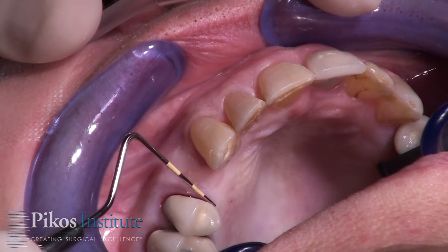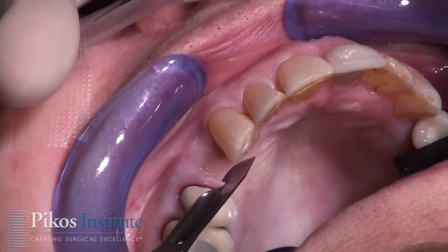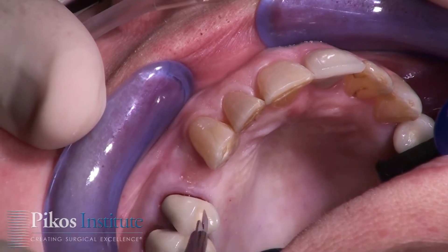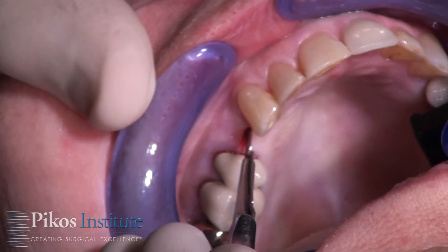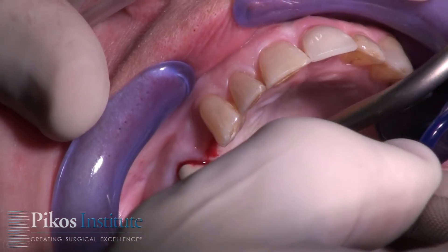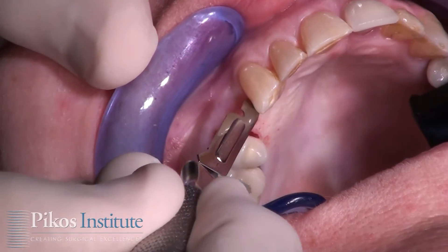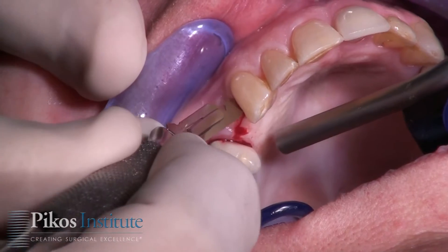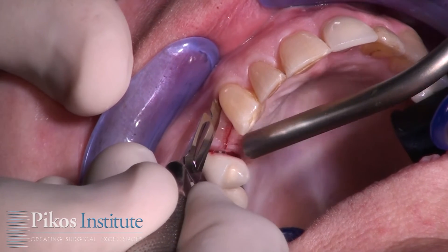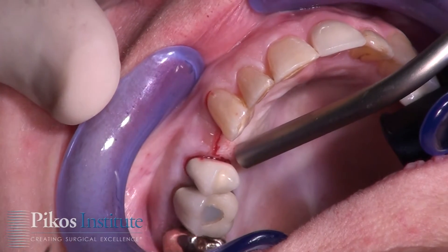From a mesial-distal dimension we'll be looking at just splitting the ridge. We'll begin with a 15C blade — I like this blade, it's a little on the thin side and allows me to make a sulcular incision very nicely versus the conventional 15. So again, a mid-crestal incision. We've made the crestal incision, now the sulcular incision will continue onto the facial about midpoint of the bicuspid and now the cuspid, which is the tooth anterior to our edentulous site.